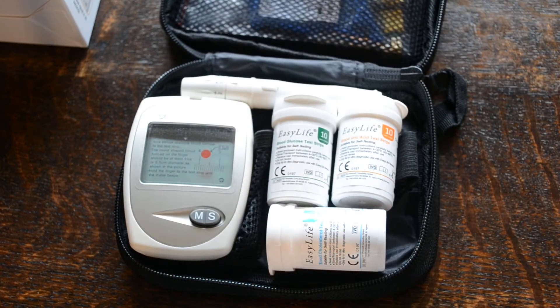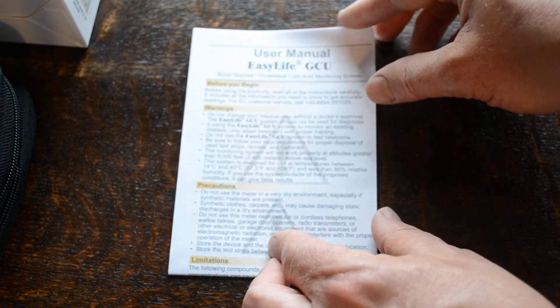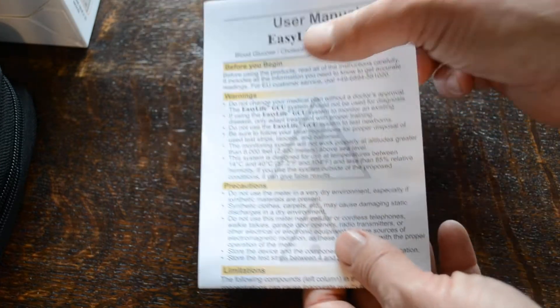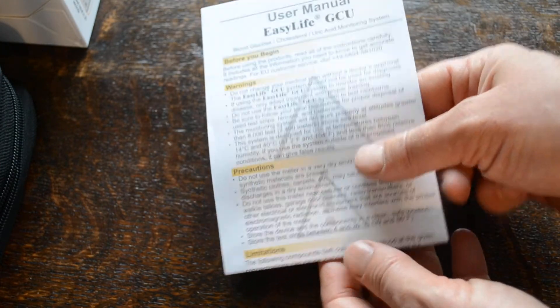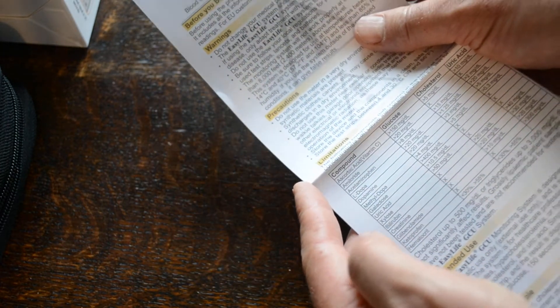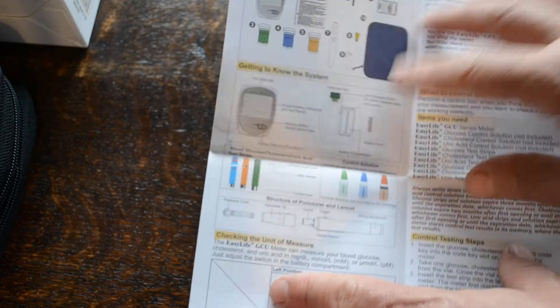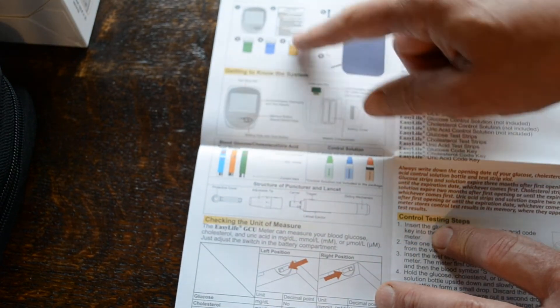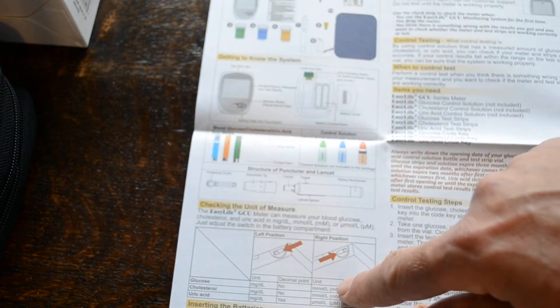If we just move now and show you the instruction manual that comes with it — this is very comprehensive, a nice English user manual. It tells you how to set the meter up, what to look for, and precautions. It also goes through common compounds that you may be taking that may interfere with results. It's a very nicely presented instruction manual with diagrams showing everything that you get and how to use it.